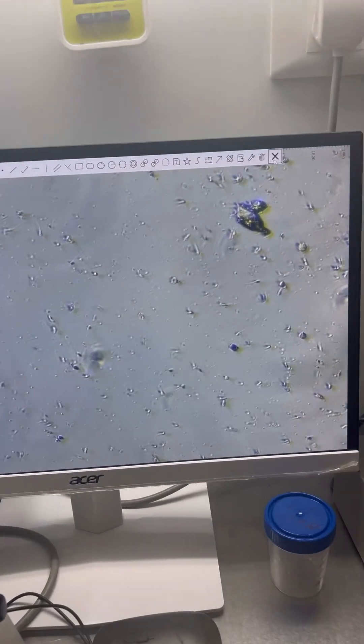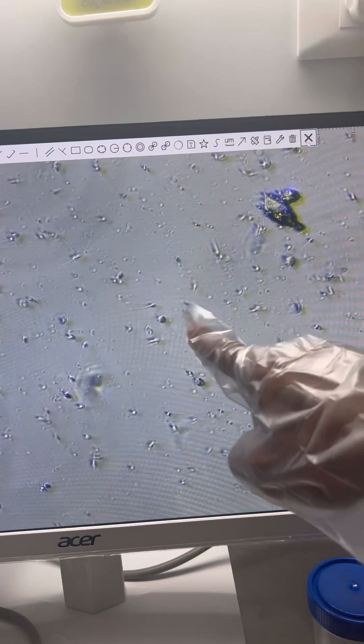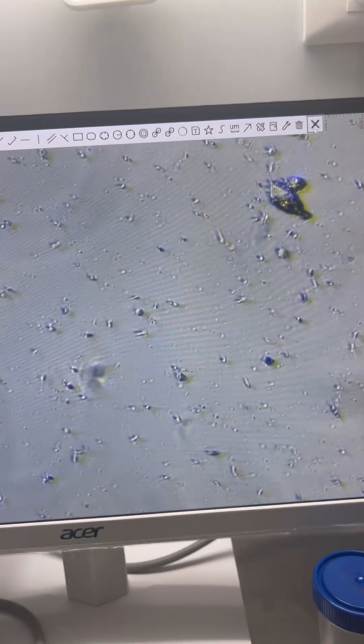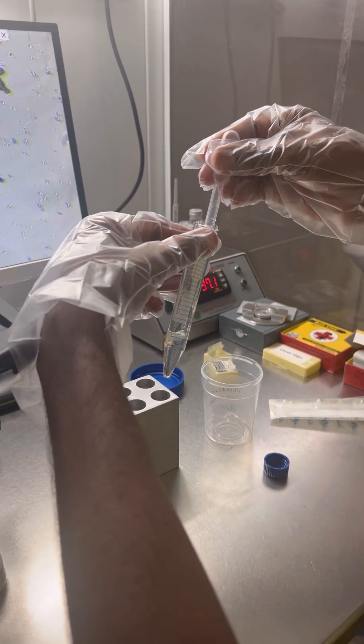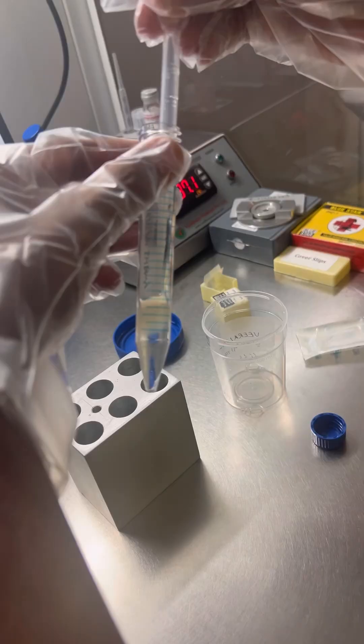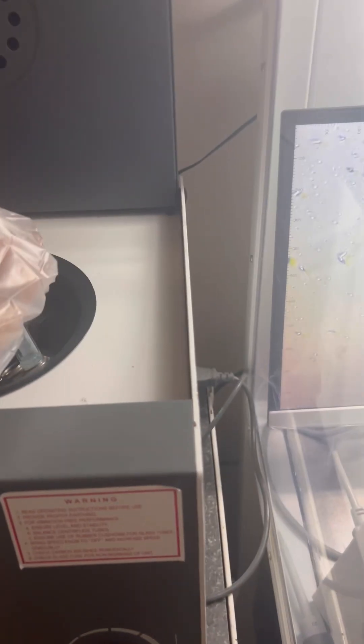Before preparing, we check the sample by placing one drop on a slide and examining it under a microscope. Then we put the semen sample in, again sliding it down the side of the test tube without mixing it with the media.